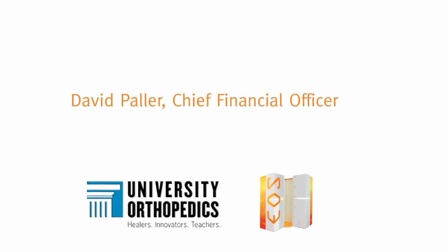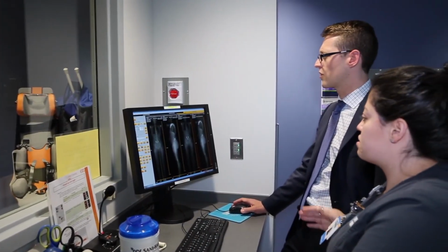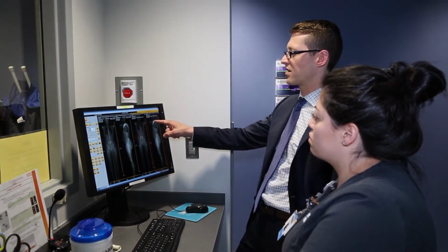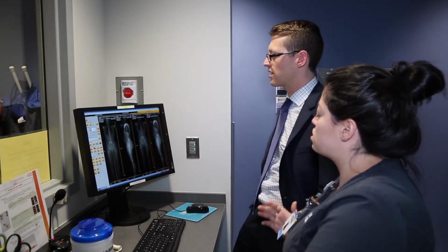Imagine the management team, we're not on the clinical side, so we're not even cognizant of these type of technologies, so the physicians would bring proposals to us, and then we'd collaborate with, say, EOS in this instance, where we learn a little bit more about the cost benefits of the technology. Being that it's an advanced imaging technology, it's more expensive than, say, a traditional DR, but there still are added benefits to utilizing this technology, and so we have to understand those benefits and basically do fiscal forecasting to see if we can make it work.